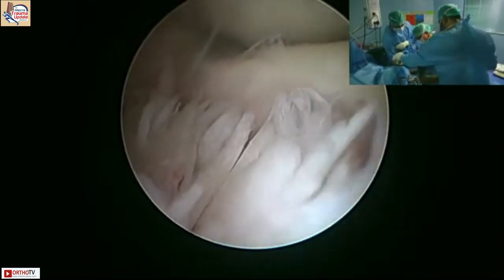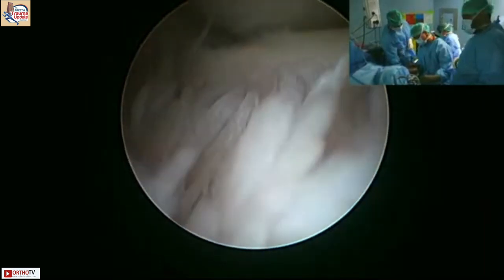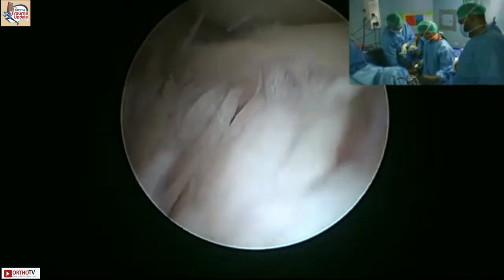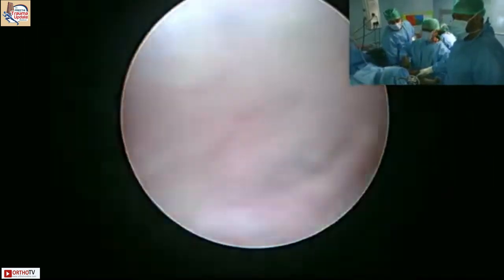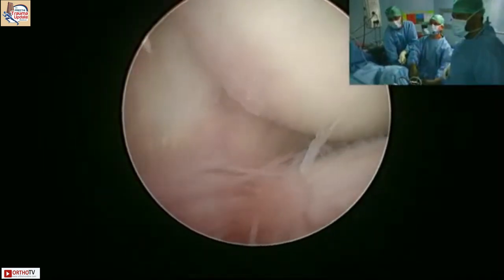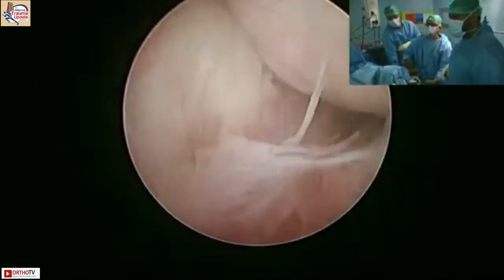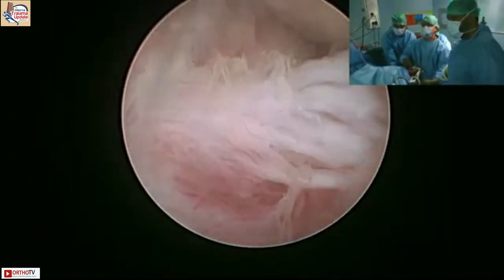So if you go proximal, then you're okay, because the radial nerve is away on the lateral side at this point. As you go distal, the radial nerve comes in. So your plan for this case is just an osteophyte removal, or are you planning capsule? So we'll do, see, he does not have much of restrictions. He's got only terminal range, and I don't think I can improve that. The reason being, he's got an elbow that is arthritic. So if the elbow is arthritic, I can't do much with it.